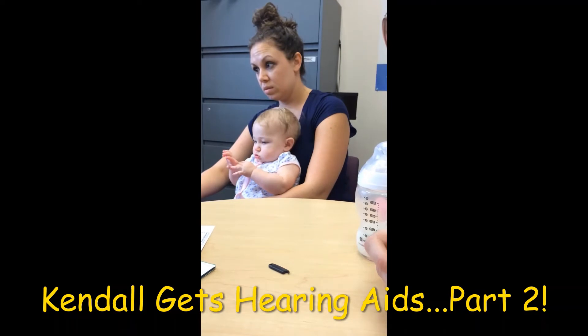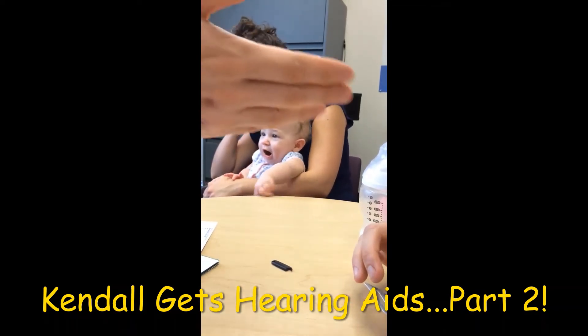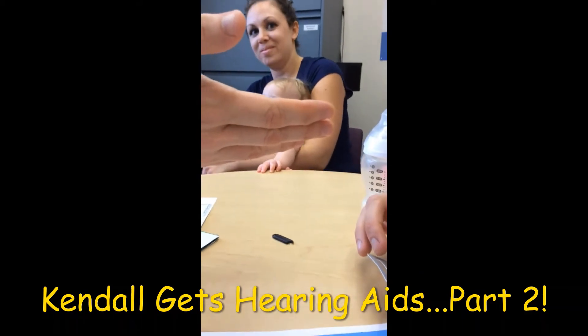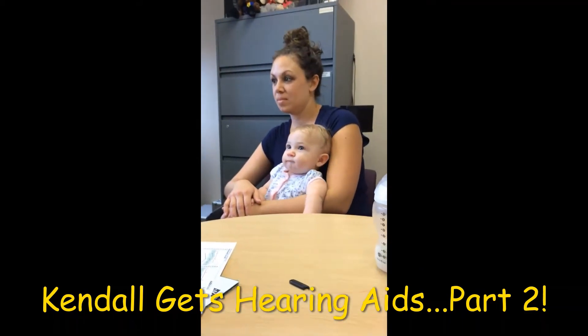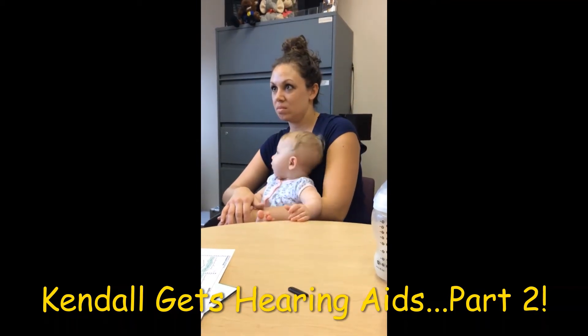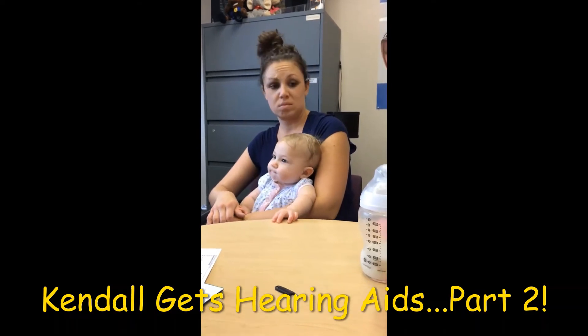So now with my left hand, it's this motion. So what we're going to be doing now — you know how to put a battery in. That's step number one. Sorry about that. Step number two is putting it in and taking it out. It's a little tricky but you'll be okay. I need to make sure you can do those two things and I'll let you go home.